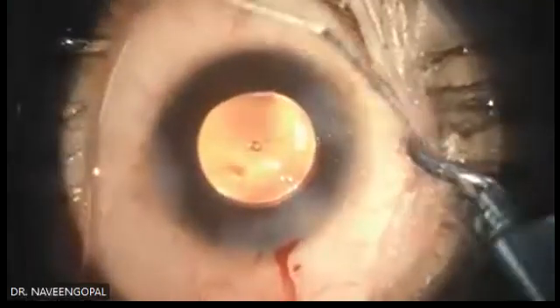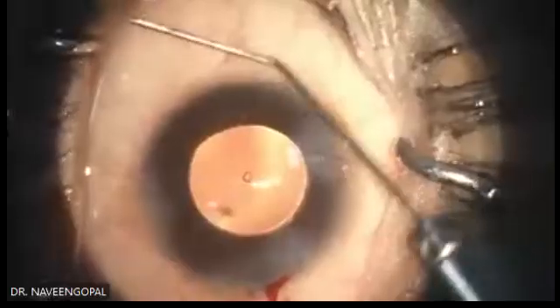Right? Oh, yes, sir. Surgery is done. One intracameral pilocarpine, done.